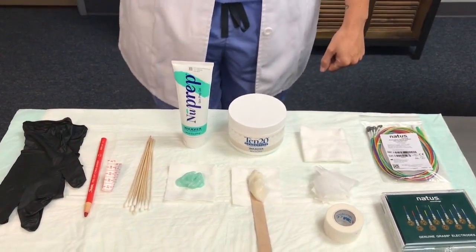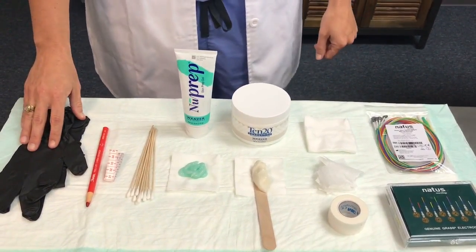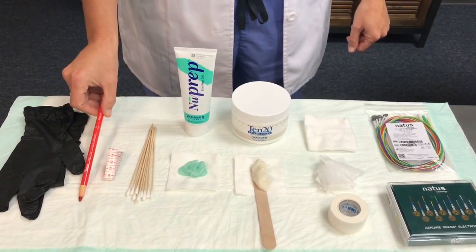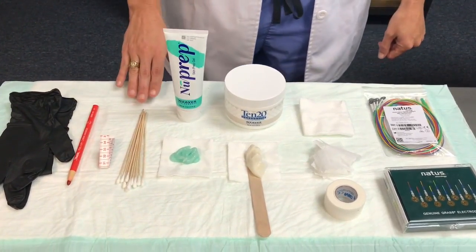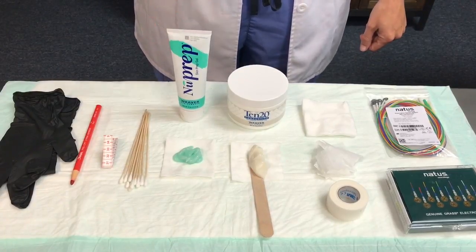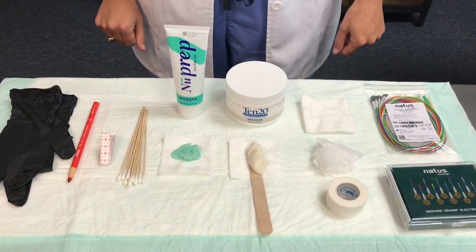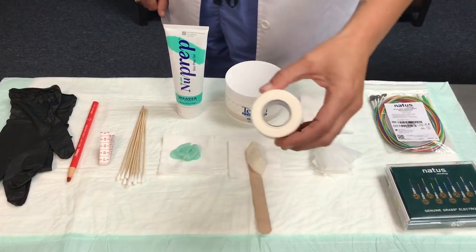Here we have a typical layout of supplies ready to use for the patient. Starting with our latex-free gloves to be in compliance with infection control policy, a China marking pencil, a tape measure, cotton-tip applicators, NuPrep or lemon prep to abrade the skin, and 1020, which is the conductive paste that will go inside the cup of the electrode, pre-cut gauze squares.